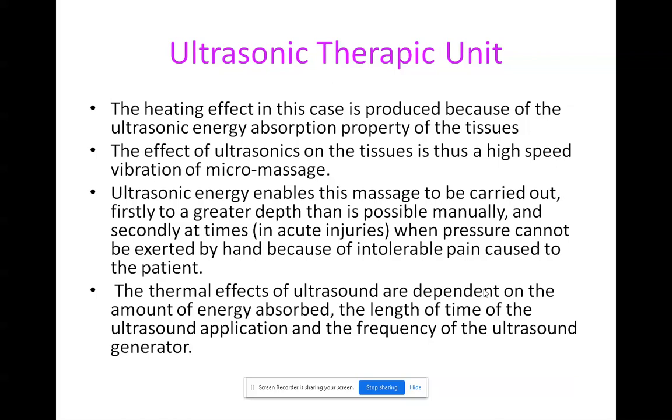The effect of ultrasonic on the tissue is thus a high speed vibration of micro massage. Okay, so ultrasonic is nothing but a sound signal which travels with high speed vibration to your body tissue, which will feel like a massage, a micro massage to the body.